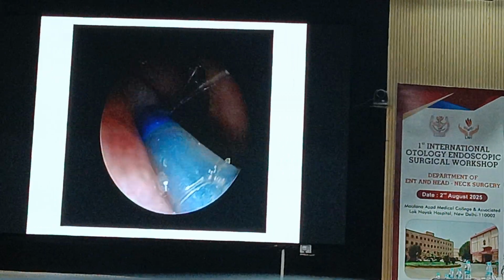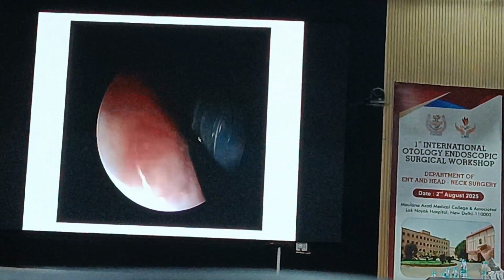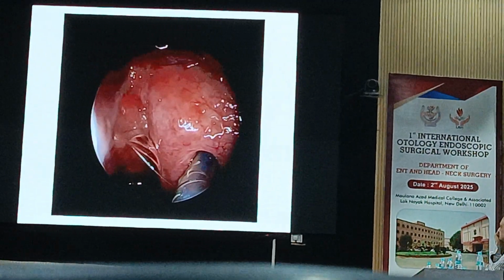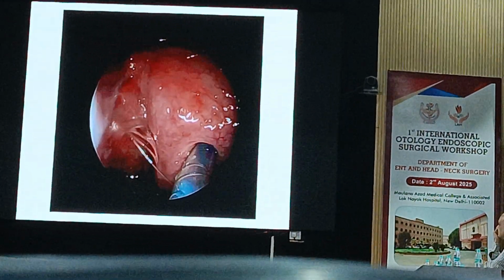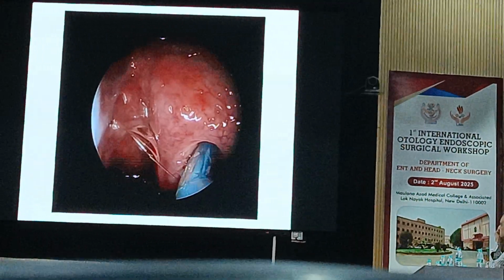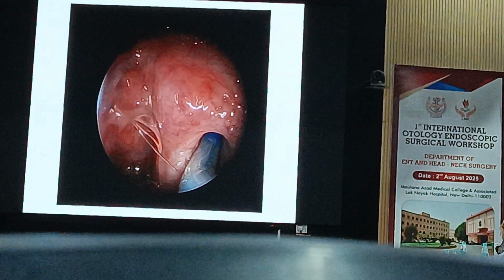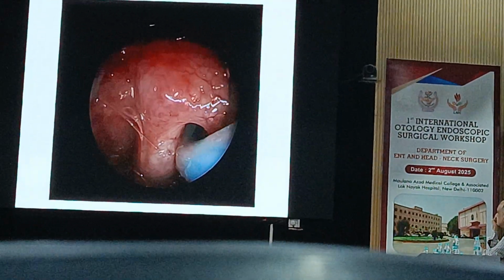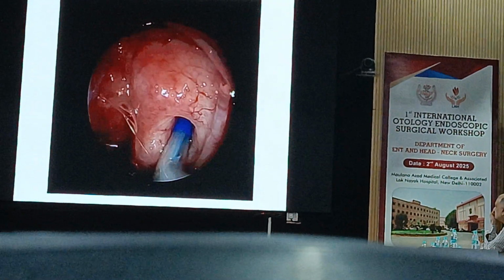The only thing is that you should know when to do it, and these are the patients who will benefit from it. The catheter is passed into the eustachian tube without any trauma. You pass in the balloon; now the balloon is coming in, and it is advanced till a certain mark, which is a black mark. It's just not visible here. Okay, and then you dilate the balloon.